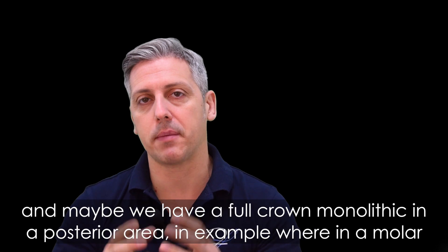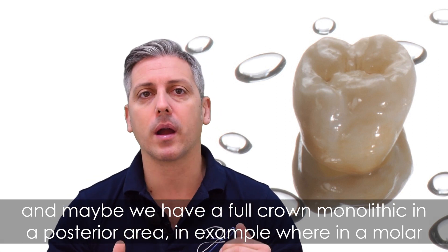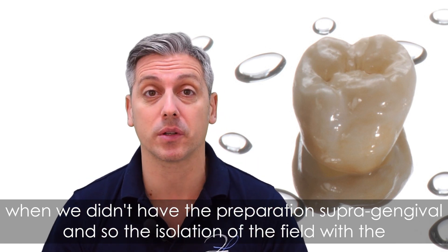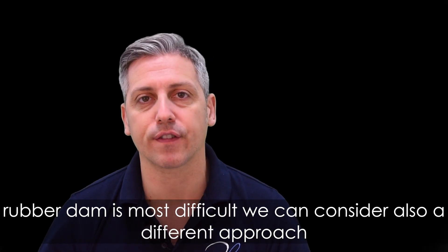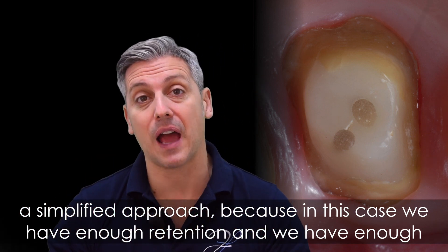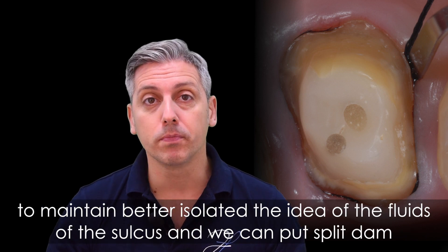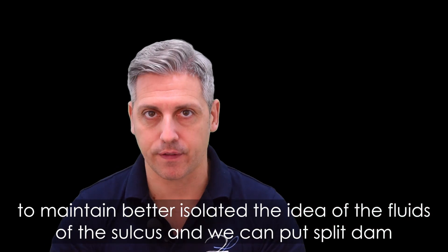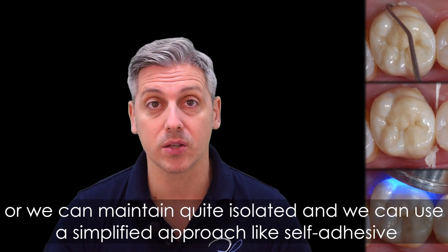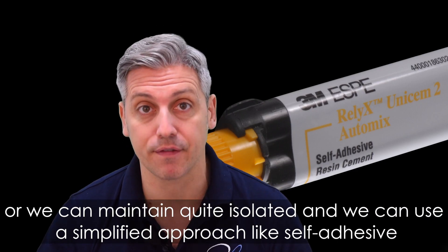In the second scenario, where we have a full monolithic crown in a posterior area — for example on a molar — where the preparation is not supragingival and isolation with a rubber dam is more difficult, we can consider a simplified approach. In this case, we have enough retention and enough resistance due to the monolithic design. So we can place a retraction cord to better isolate from sulcular fluids, and use a split dam or maintain reasonable isolation, and then use a simplified approach like a self-adhesive cement.